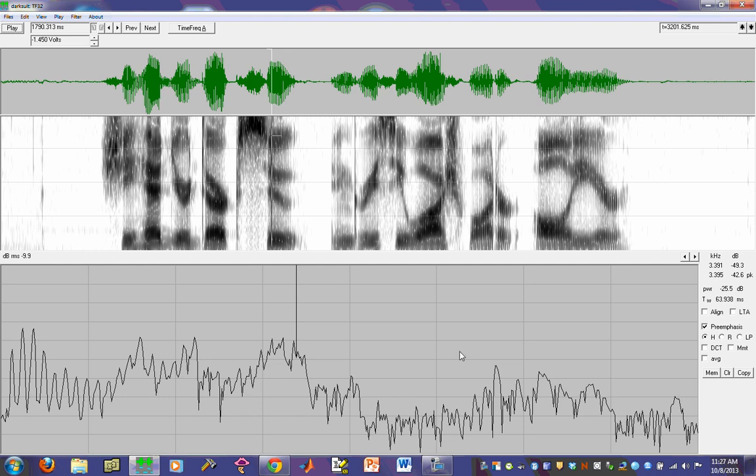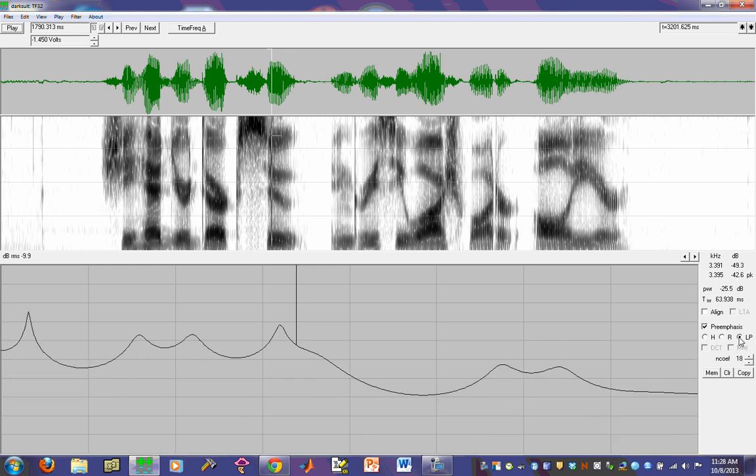There is an actual way that you can switch displays from the H, which is providing you with the FFT or providing you with harmonic information. You can click on what's called LP, and that gives you what's referred to as a linear prediction coding spectrum. It's an LPC spectrum, and this is akin to what I describe in class as the spectrum envelope. So, it's smooth. It's providing you with where the general bands of energy are in the system and allow you to more readily identify things like the formant values.